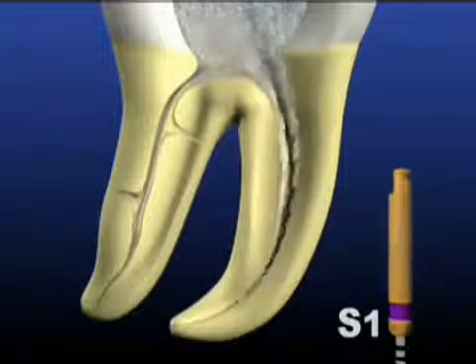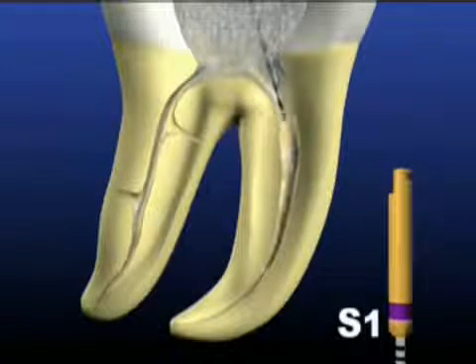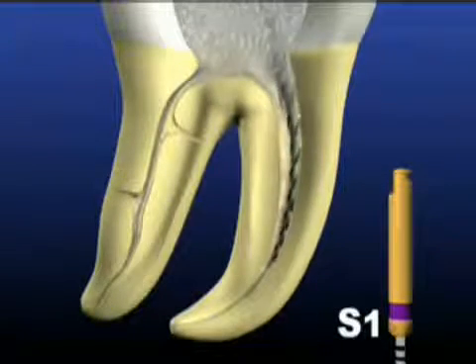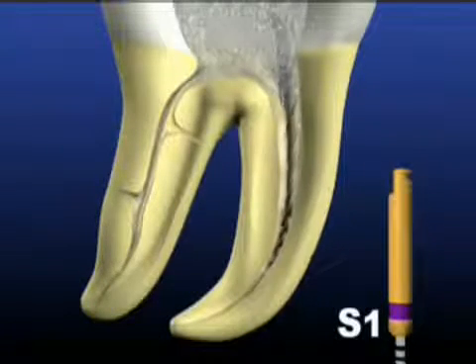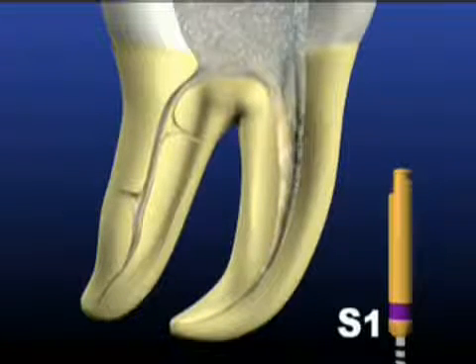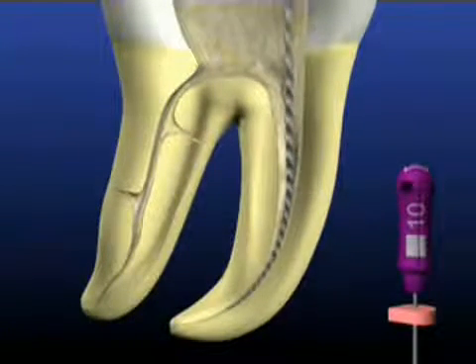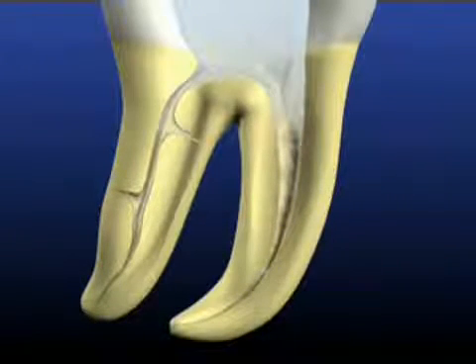Remove the S1, clean and inspect the file. Reinsert the S1 to continue shaping the coronal area, employing a brushing motion to improve access. This is accomplished when light resistance is encountered by withdrawing the instrument and cutting the dentin on the outstroke. In more difficult canals, it may require a couple of recapitulations to enlarge the coronal two-thirds of the canal. Now irrigate.